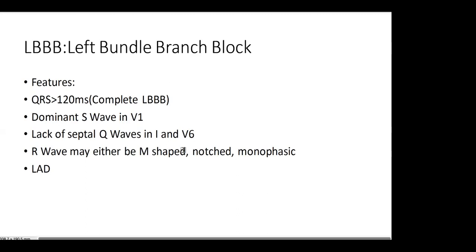So to start with, in the same way we have a pathology in the QRS complex with blockage of the right side, we have a deformity in the QRS complex when we talk of left blockage. But what distinguishes it is where you find these deformities. As said before, V6 is on the left side, V1 is on the right side. So basically, let's go back to the physiology.